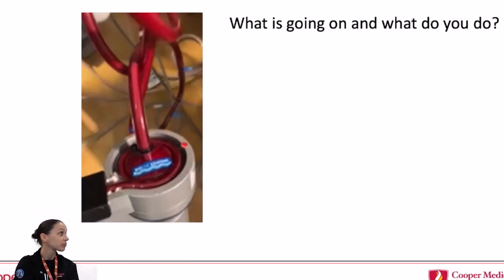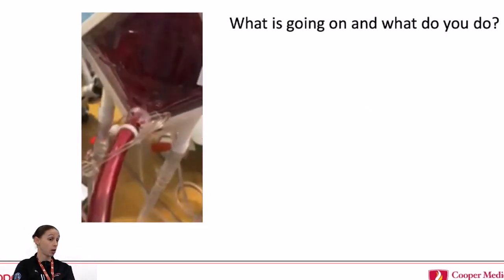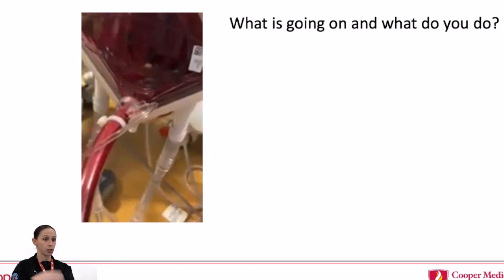Very good. So why would COVID be relevant? We saw it more than once, and actually the patient that we encountered was a COVID patient, and what we think is there was a thrombus inside the cannula that then got transmitted to the pump, and those pumps are rotary pumps, and a thrombus, an airlock, anything can sort of disengage that pump, and so it started making that rattling noise. So what do you do?